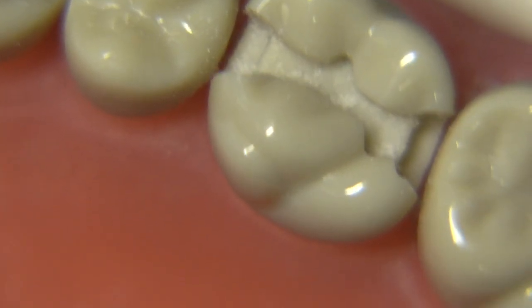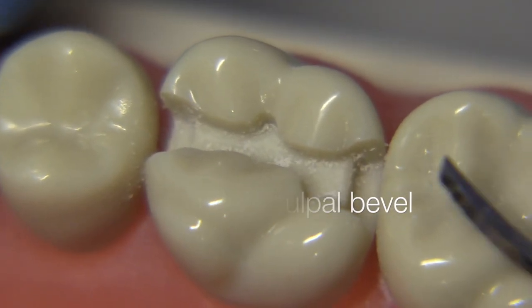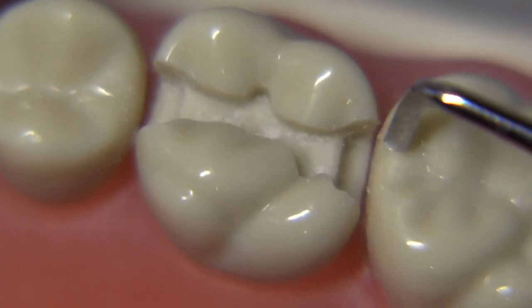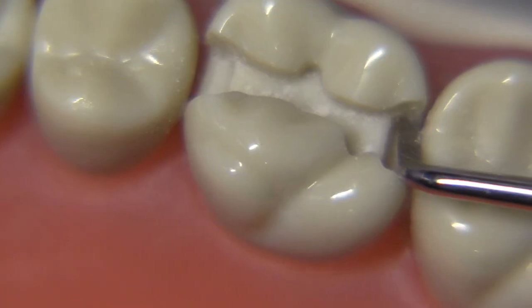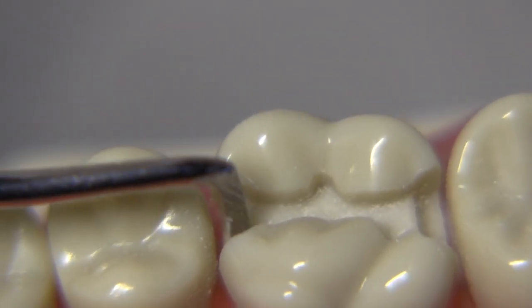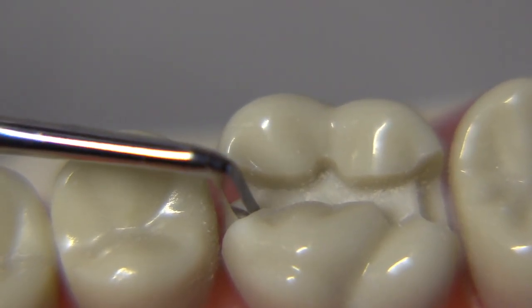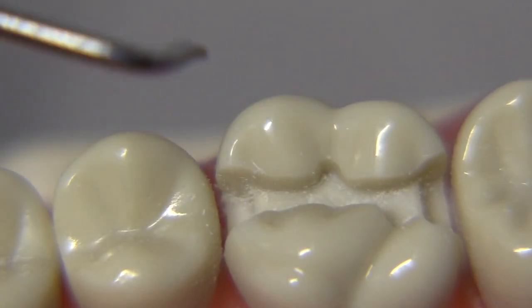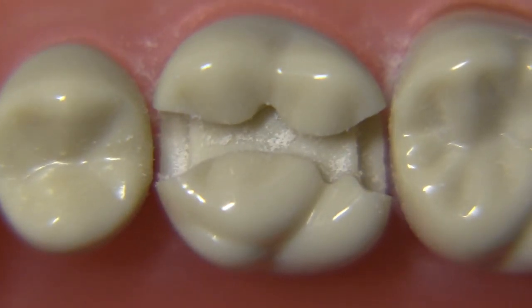Let me show you how we use the GMT instrument to make the bevel. We start in the middle of the axial-pulpal area and go towards one side, then flip the instrument around and go from the middle to the other side. You can put a slight 20-degree declination angle to half of that wall on the gingival. Same thing on the other side — start in the middle, twist the instrument towards the lingual to create a little 0.3-millimeter axiopulpal bevel. Then in the mesial box, start right in the middle and work towards the facial, going over that gingival just a little bit more if needed.